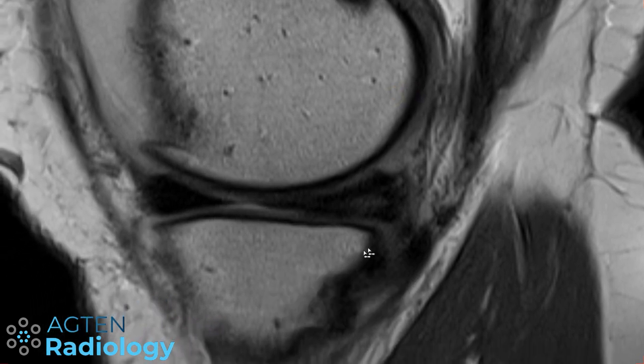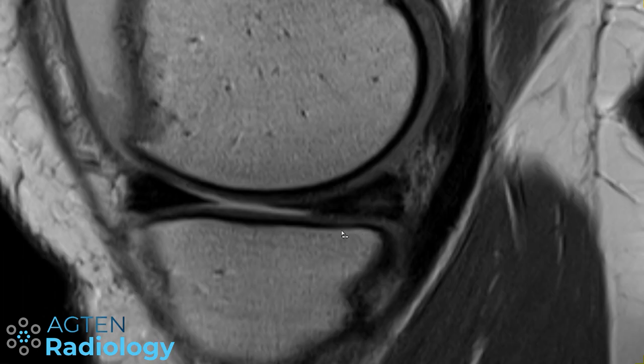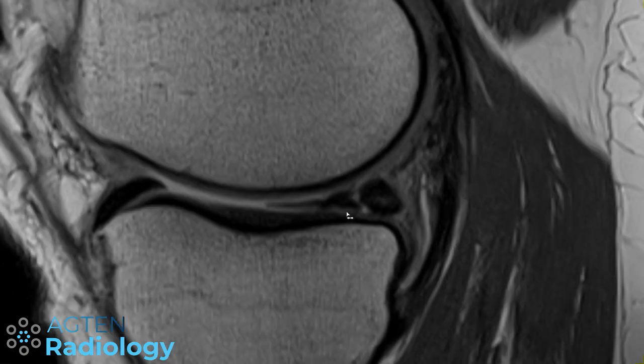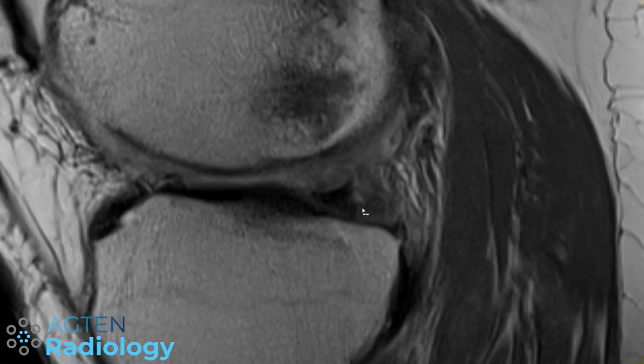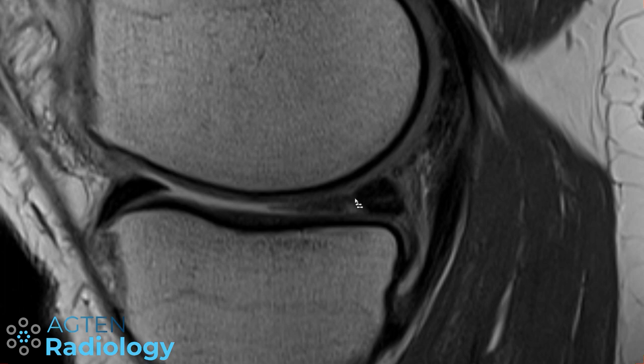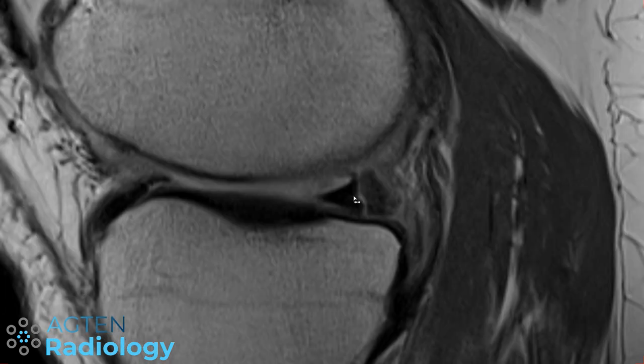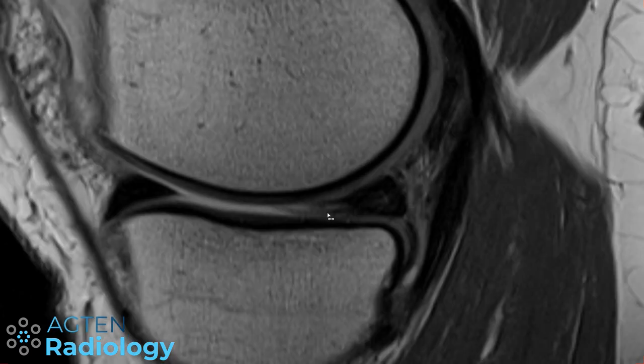So this is another patient and brings us to another variant of a meniscus tear. And you can see here we have some fraying of the edge here. And then suddenly we have the tear. This time it's longitudinal here, and it's running through here. So as you can see, as I scroll through, it changes the orientation.